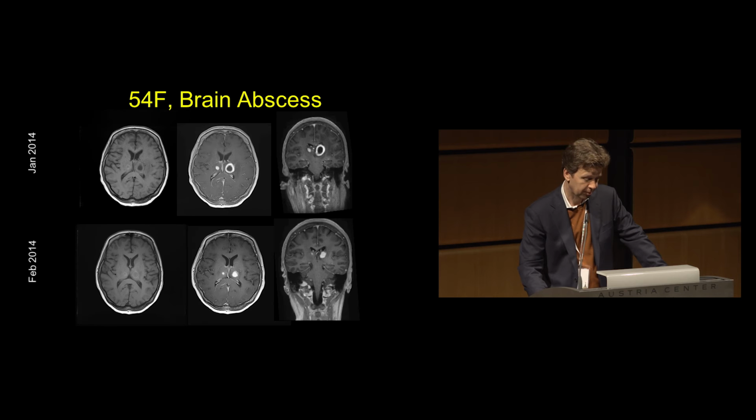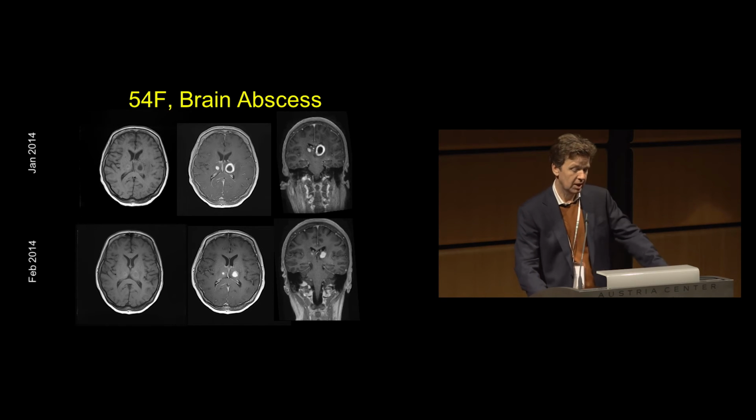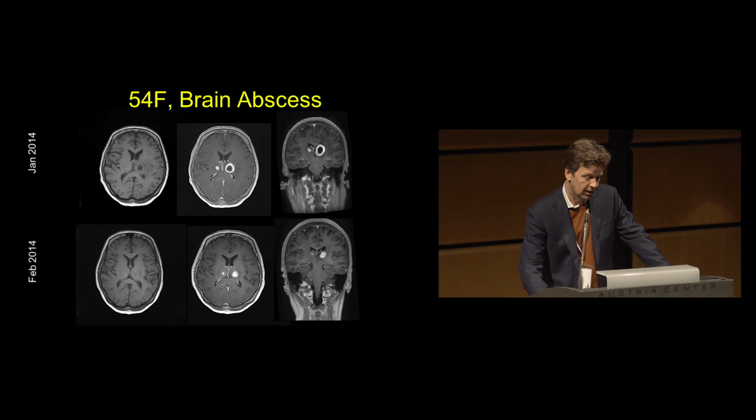antibiotics only. Here's from the same case the T1 weighted images. So this is a coronal reformat from the sagittal T1 and then axial T1 spin echo before and after contrast. Notice again that is good quality T1 spin echo, which is difficult to achieve usually at 3 Tesla.